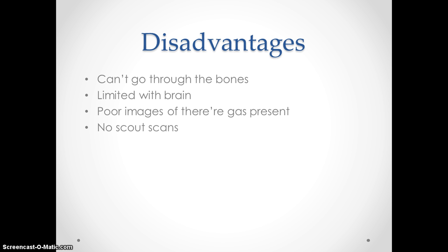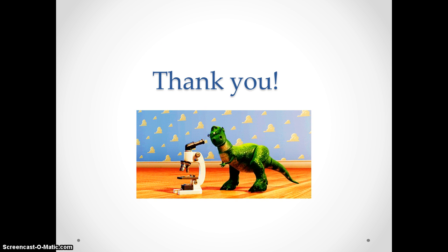And there are also no before and after images unlike in MRI or CT scans, but in ultrasounds there are only live images, and the quality is limited and it's operator dependent.